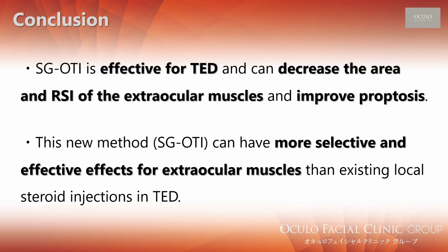SG-OTI is effective for TED and can decrease the area and RSI of the extraocular muscles and improve proptosis. This new method, SG-OTI, can have more selective and effective effects for extraocular muscles than existing local steroid injections in TED.